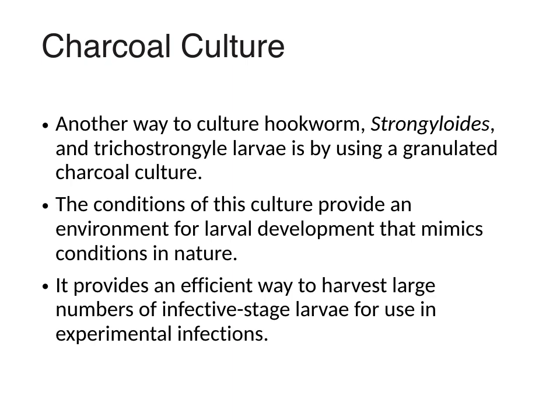Charcoal culture. This technique is used to culture larvae in conditions that mimic conditions in nature. And this technique provides an efficient way to harvest a large number of infective stages in experimental conditions.